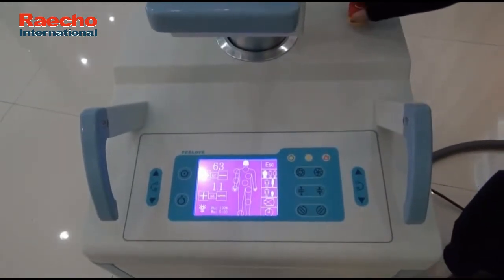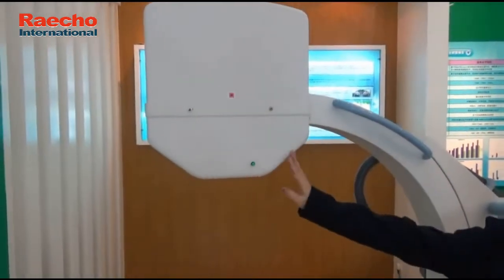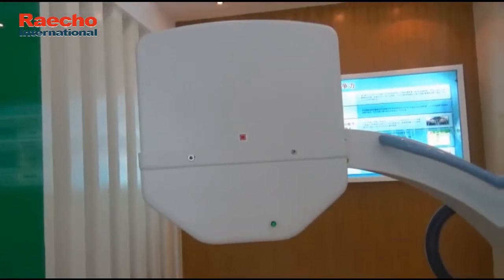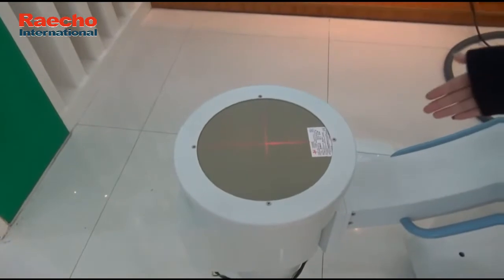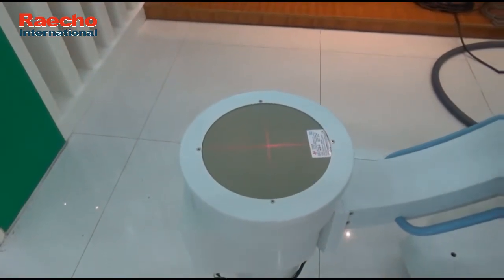In addition, there is an infrared position lamp on the tube, which helps the doctor determine the position during fluoroscopy or photography. After it is opened, the light will remain on for 30 seconds and then automatically turn off. If necessary, it can be used many times.